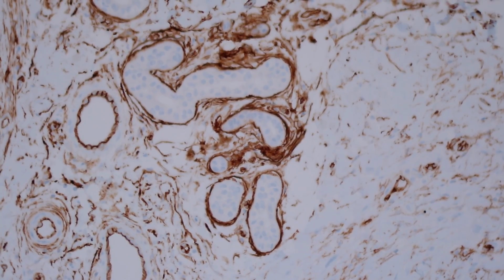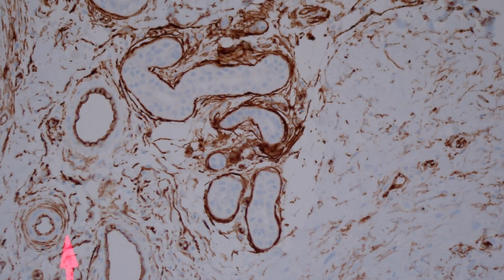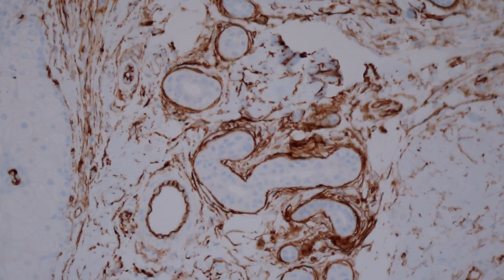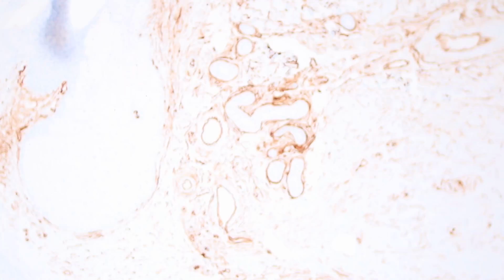Here, these are the eccrine coils, and you can tell that they're totally negative. All their cells are negative. All the staining that you're seeing here is the layer out on the outside, the layer of stroma from the dermis that's wrapping around the outside of each individual part of the eccrine coil. And then these are vessels here, right next to it, and you can see the nice endothelial lining of the vessel staining with CD34.